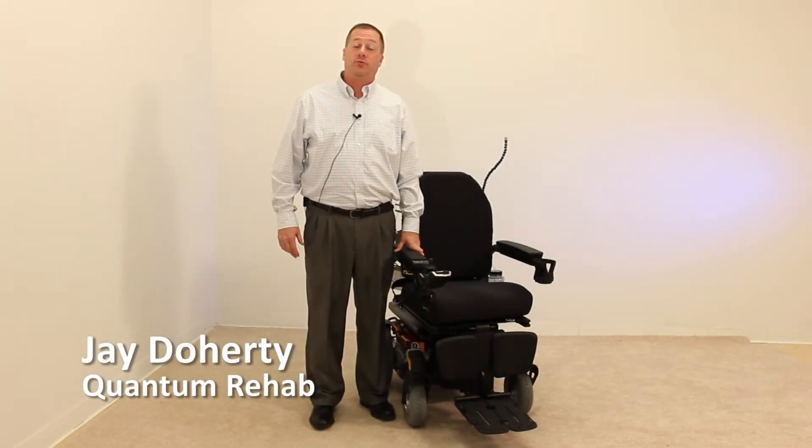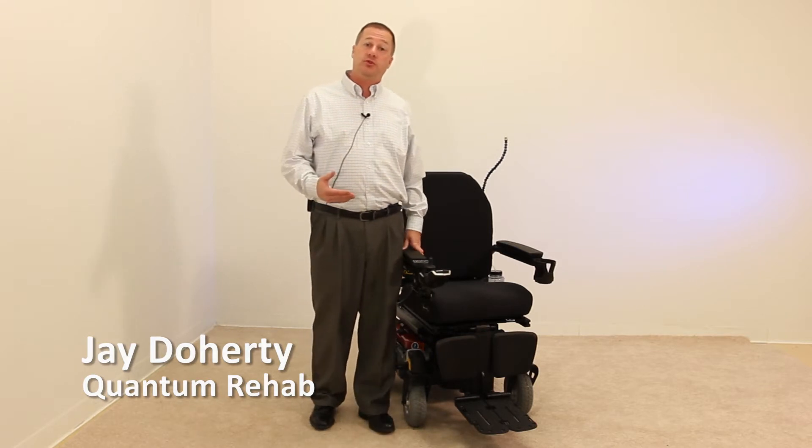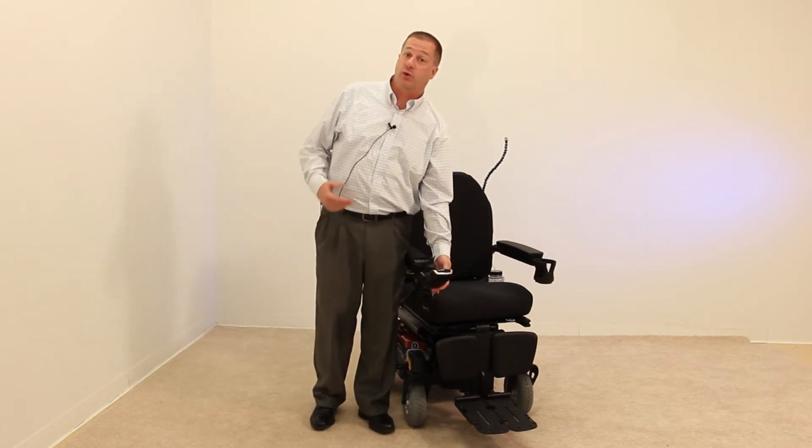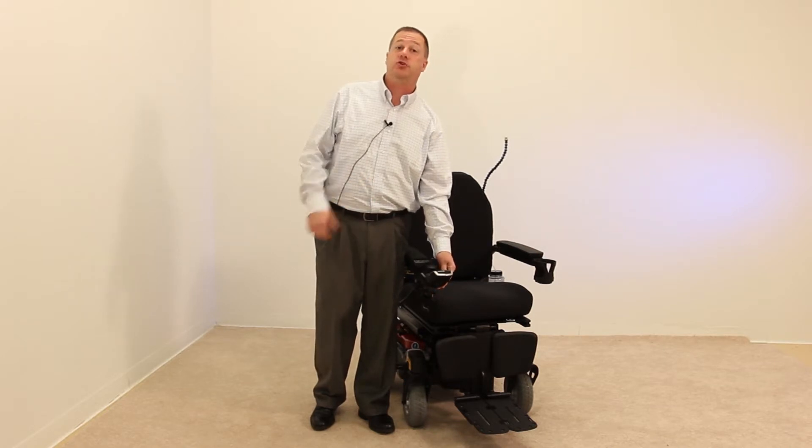My name is Jay Doherty with Quantum Rehab. I'm going to review the steps on how to link your Q-Logic 2 hand control with Bluetooth, which is a standard feature in the Q-Logic 2 hand control, with a Windows tablet.